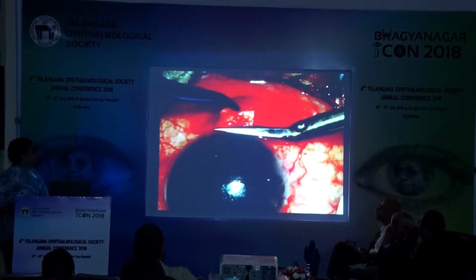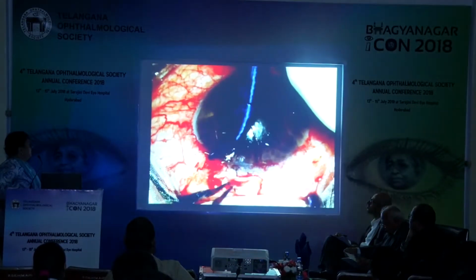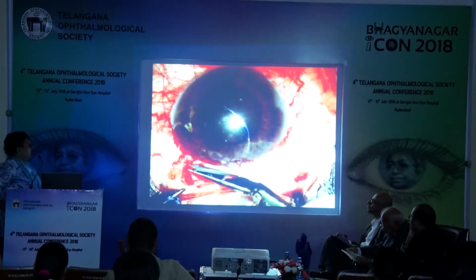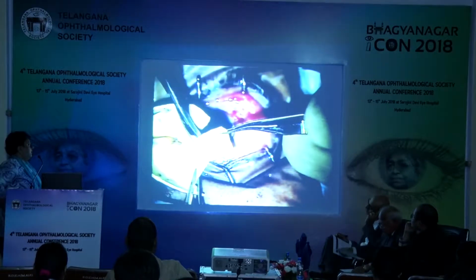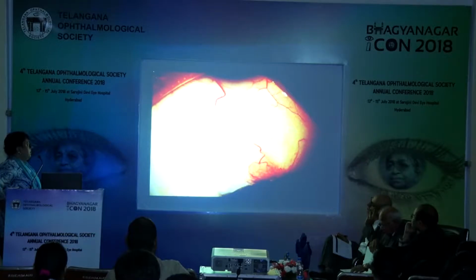In this case, some smart thinking helped us to mitigate the adverse condition. Therefore, autologous partial thickness sclera is a viable alternative to full thickness donor sclera for repair of fistulae post trabeculectomy with mitomycin C.